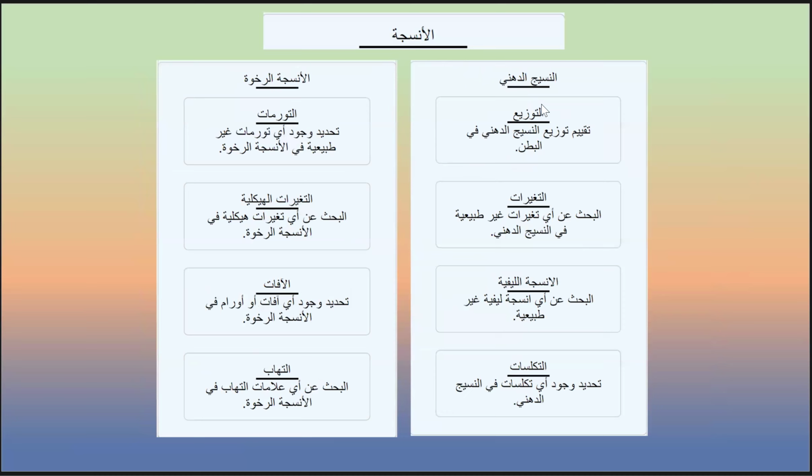In the tissues, we look for the fatty tissue, and we see the fatty tissue of the abdomen. Any changes in the fatty tissue, we look for the fibrous tissue, and we look for the calcification. And we look for the soft tissue, we look for the masses, cysts, we look for the changes in the structure of the soft tissue, and we look for any masses or cysts in the soft tissue, and we look for signs of inflammation or others.